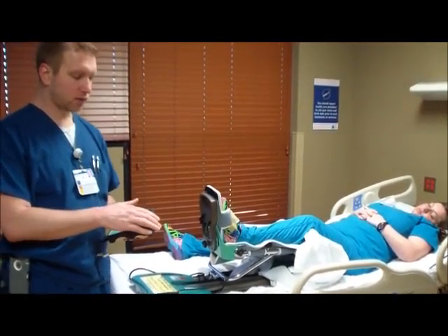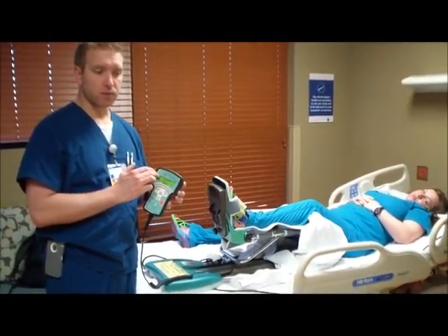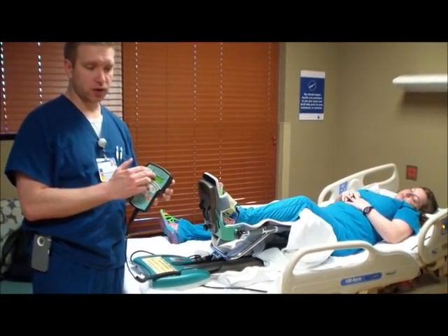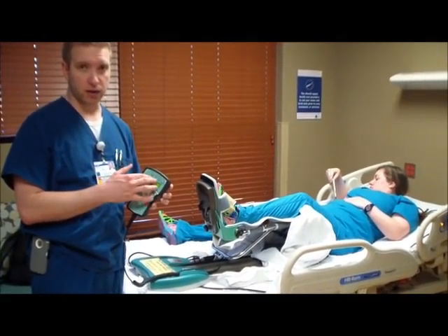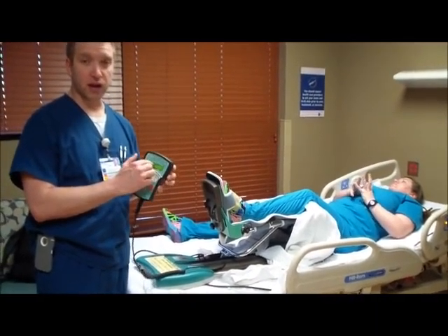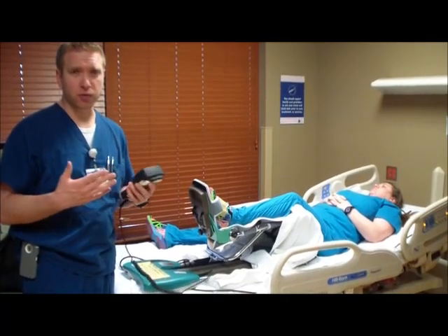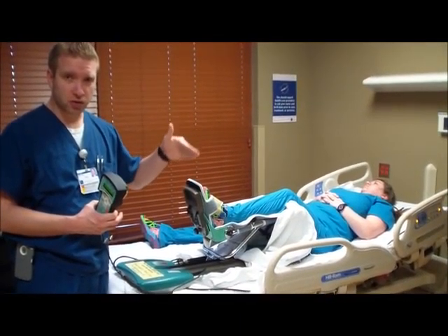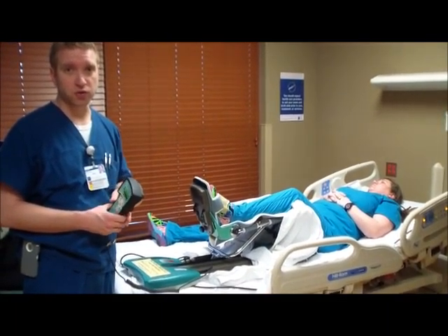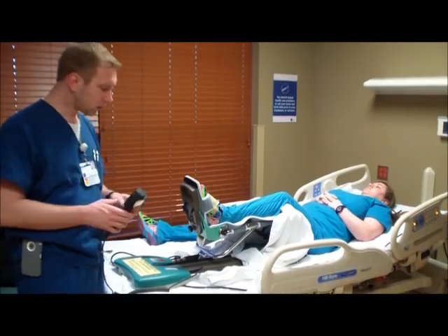There's different aspects that you may see on this device. If it says maintenance needed, we'd like you to not use that one so we can pull that out to figure out why we need to do some maintenance on it. There's other ones that will say a warm-up feature. We don't really know how to turn that part off, but it'll just kind of bring them up slowly and surely into that total range of motion. There's ways to bypass it that we can cover with you as well.